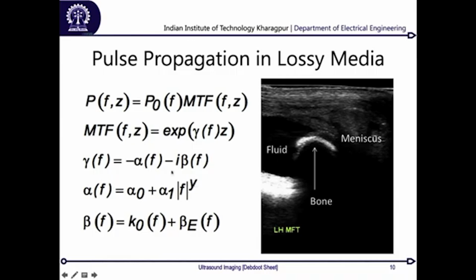Now, as you see, if we look through this whole cumulative set of equations along with alpha and beta, you would see one particular thing: at the same depth, if you have a higher frequency, you have a larger attenuation, right. So, it is definitely always very profitable to run at a lower frequency, right. But is that always a very good idea, is the question.